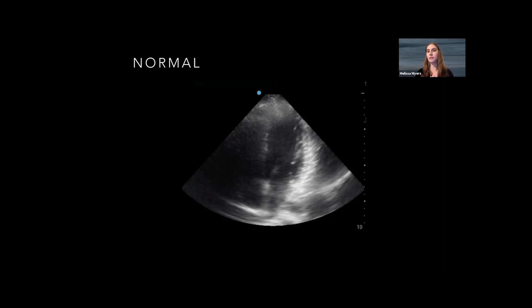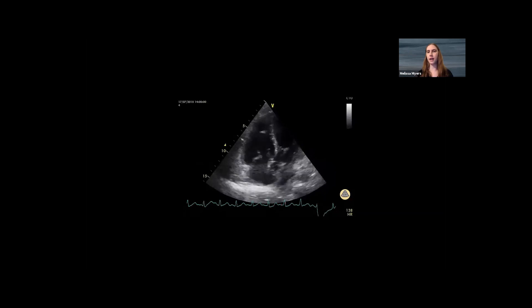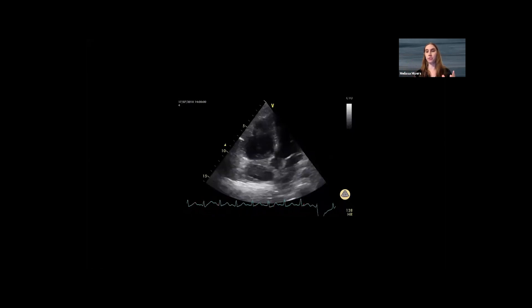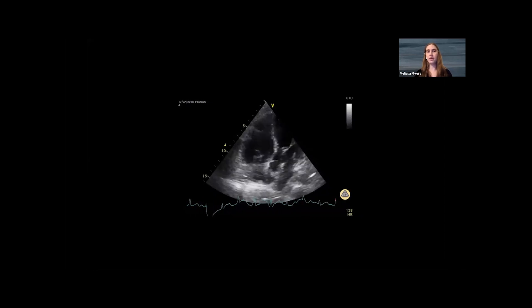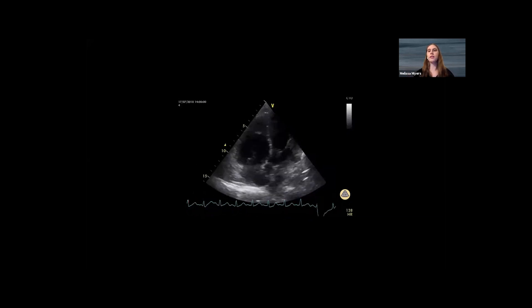In a normal healthy person, the right ventricle is approximately two-thirds the size of the left ventricle. Any larger than that, we start to be concerned about right ventricular dilation, which is often associated with pulmonary embolus — the right ventricle just kind of blows up because it has thin walls and reacts relatively quickly to changes in pressure. A ratio of 0.6 to 1 is concerning, and anything greater than 1:1 is definitively abnormal — your right ventricle should not be larger than your left ventricle. Here we have a very abnormal right heart where the right ventricle is as large or larger than the left ventricle.